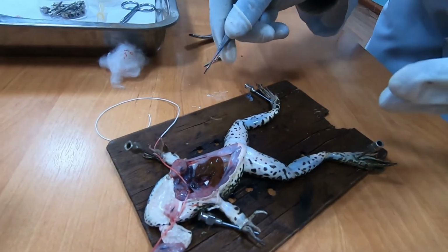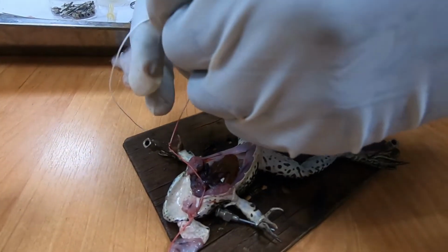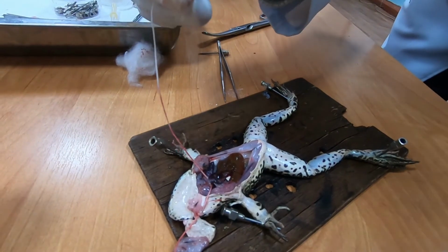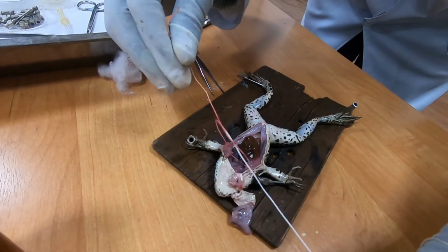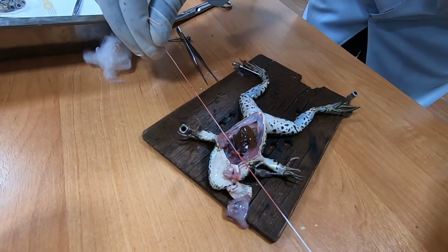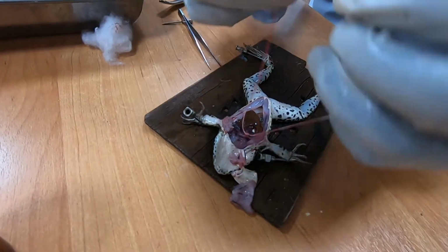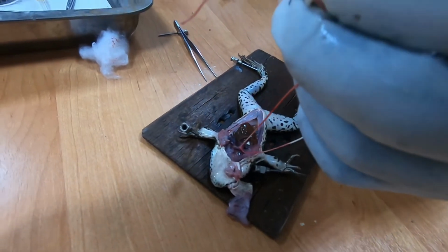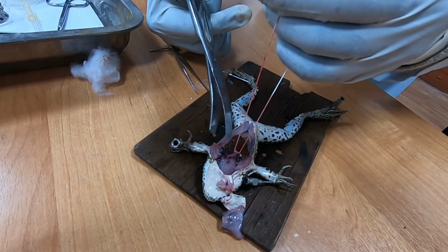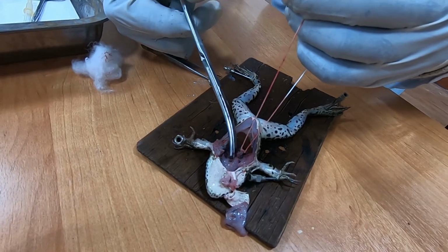So this is how we're going to do, while the heart still beats, and we're going to take it out from the chest cavity.